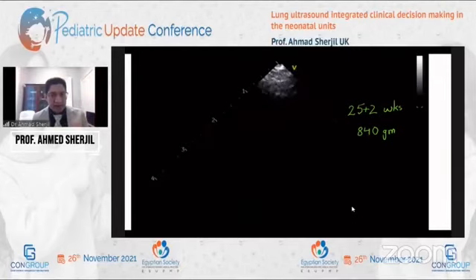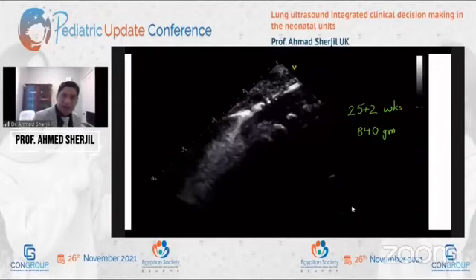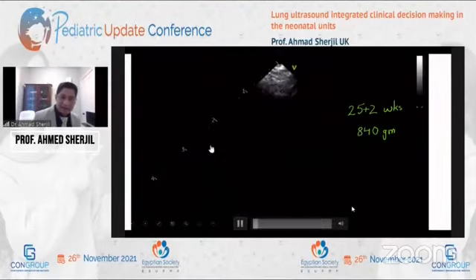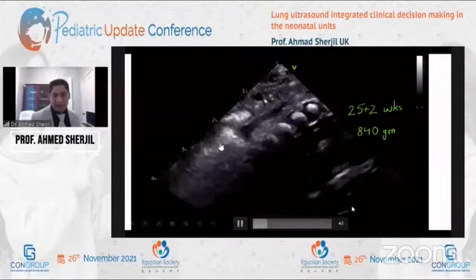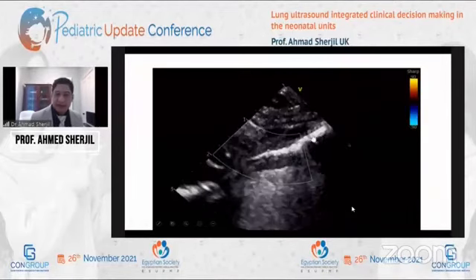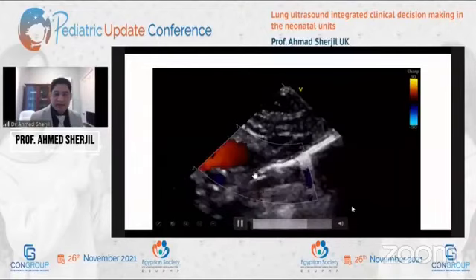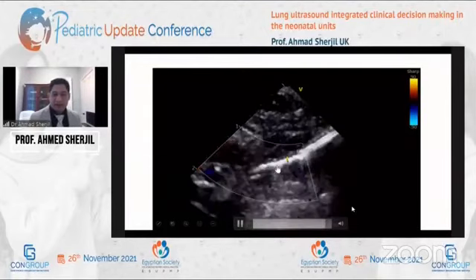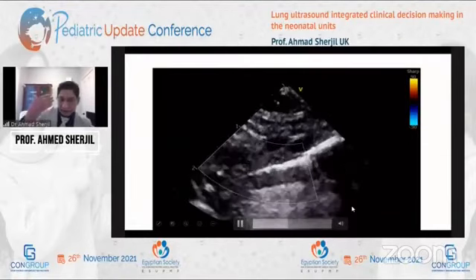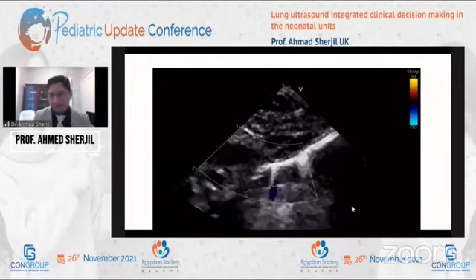So I knew that I don't have to worry about how the tube is being secured, and the distance from the pulsating aorta is pretty decent as well. And if you're really adamant on measuring it, you can see the two parallel lines, they finish here, and there is this aortic arch and the origin, and you can just freeze it and measure it. But even without measuring, you can see that it's an acceptable position, not too deep, not too high.